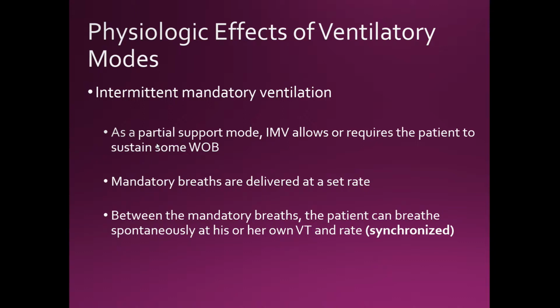AC mode is full ventilatory support regardless, because you're not going to set a respiratory rate of 8 on AC unless you have a really large tidal volume that would equal out your minute ventilation, which probably won't happen. So that's why we say that AC mode is full ventilatory support.